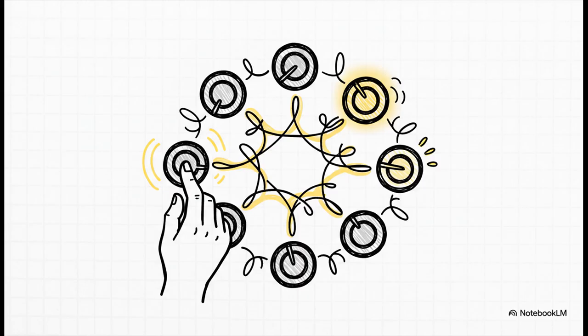See, here's the thing. Immunoassays are not simple A plus B equals C systems. They are a complex web of interactions. Think of all the knobs you can turn: coating concentration, blocker choice, wash strength, incubation times. They're all connected. And when you turn one knob, it doesn't just have one single effect. It can quietly, behind the scenes, change the perfect setting for a totally different knob.